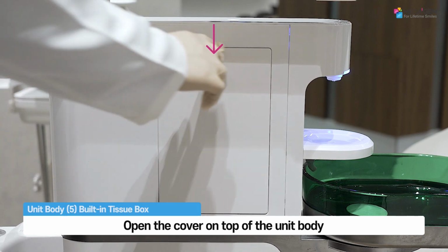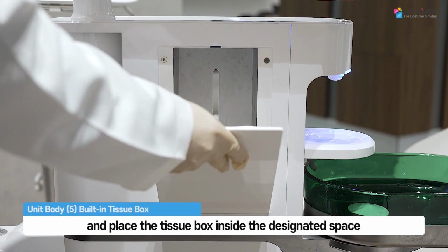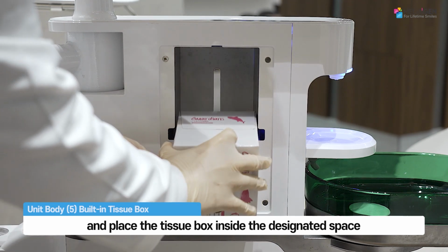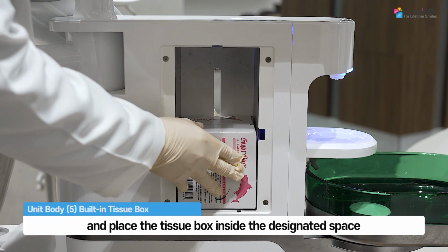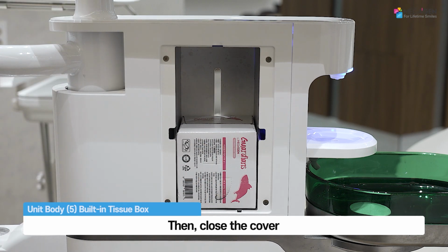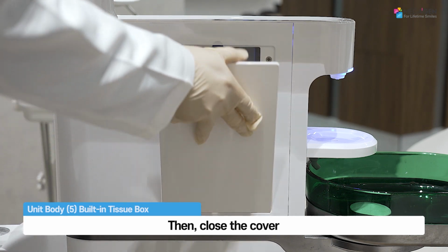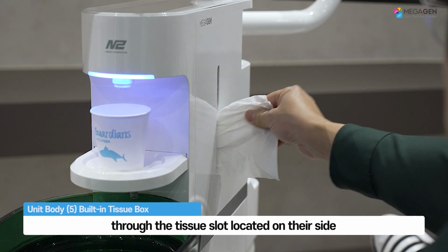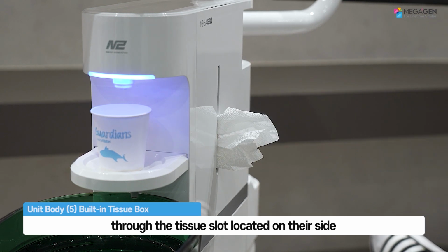How to use the built-in tissue box. Open the cover on top of the unit body and place the tissue box inside the designated space. Then, close the cover. The patient can take tissues one at a time through the tissue slot located on their side.